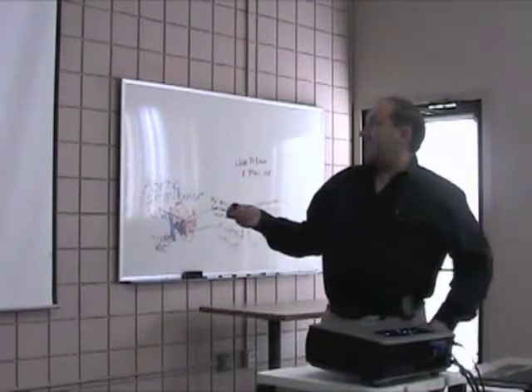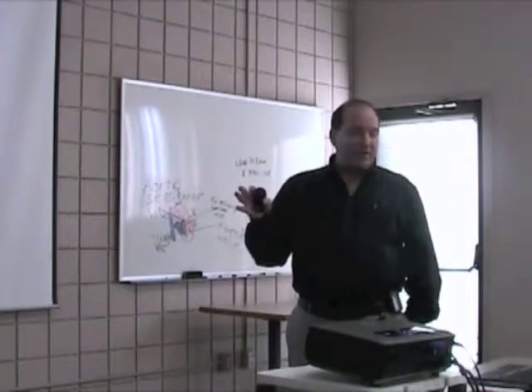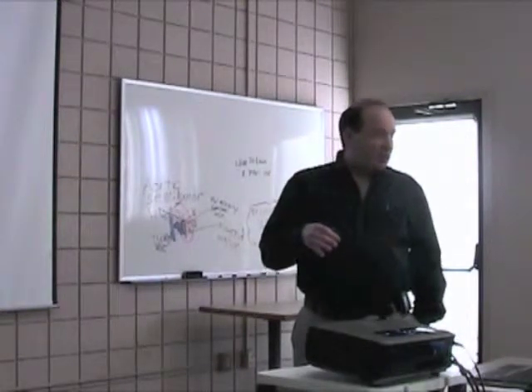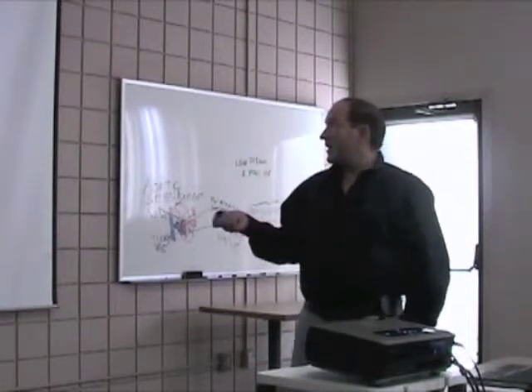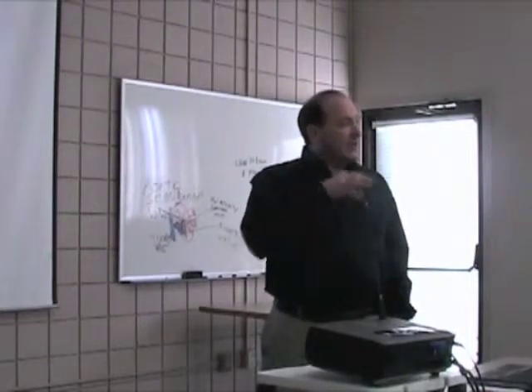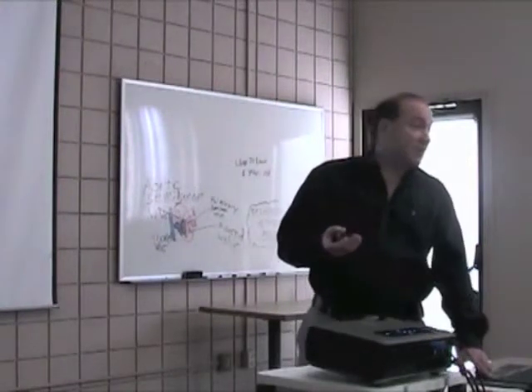So the valves that we take out of cows or pigs cannot be transplanted in a fresh state. If we take a valve from a cow or a pig and put it in a person, it's recognized as a foreign body, a foreign protein, and the body will then tend to reject it. We don't use immunosuppression the way we do with transplants when we do valve surgery. The way we get around that is they're preserved and treated with fixing agents. These are chemicals that the valve is immersed in by the company, and it kills or destroys the proteins on the surface of the valve so the human body doesn't recognize it as foreign. And that's the reason why you don't get rejection of heart valves.